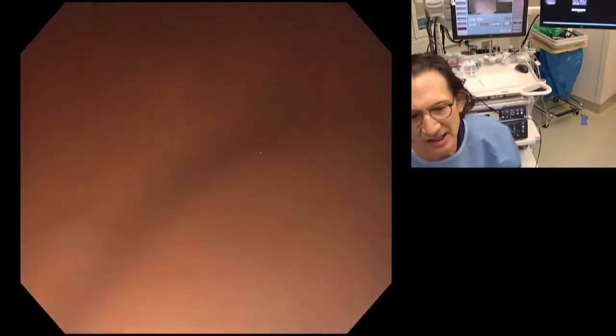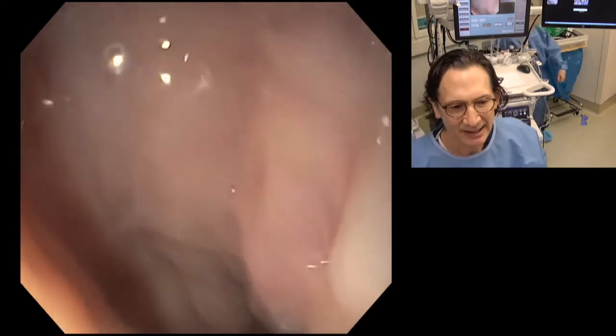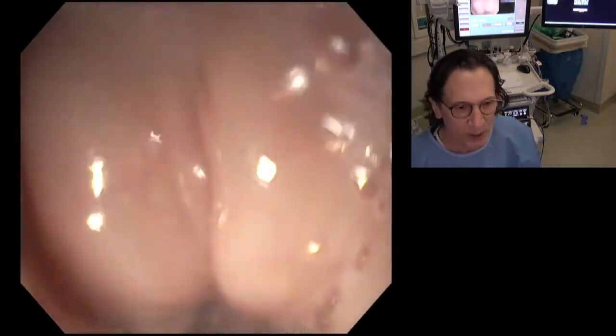So we're passing this oblique viewing echo endoscope down, and I'll just make a few comments as I'm going through, since we have fellows also in the audience who would benefit from the teaching, I think. It's important that when you cross the GE junction, the cardia, that you have this under some view. Just don't blindly push in here.